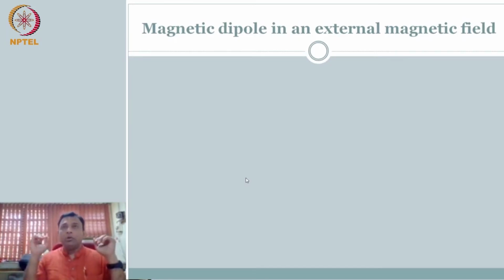So we talked about the analogy between the spin and the bar magnet, the spinning proton and the bar magnet. And then what we noticed is, if you take the bar magnet and put it on the table, you may have 10 pieces of bar magnets. You put them on the table and you throw them such that they are all falling in different directions initially. But then you'll notice that quickly they will all align to the Earth's magnetic field. That is, when you subject this to an external magnetic field, which is the Earth's magnetic field, they will all nicely align themselves. Of course, you have to give some finite time. You throw it and then quickly it will all reorient.